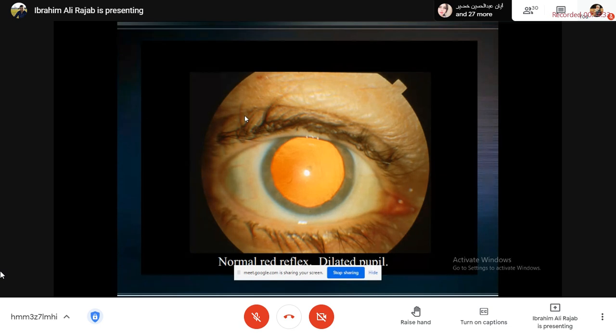You can see in photos, if someone uses a flash, you see for example a person in the photo whose eye becomes red. This is normal, that the reflection of the light from the pupil is red. This is normal. Why does one person in the photo look like this and the others don't? As I said, there is a special situation. You should be slightly oblique to the eye of the patient, and you use the light. In a special situation, the red reflex will appear, and you will notice the reflection of this light.